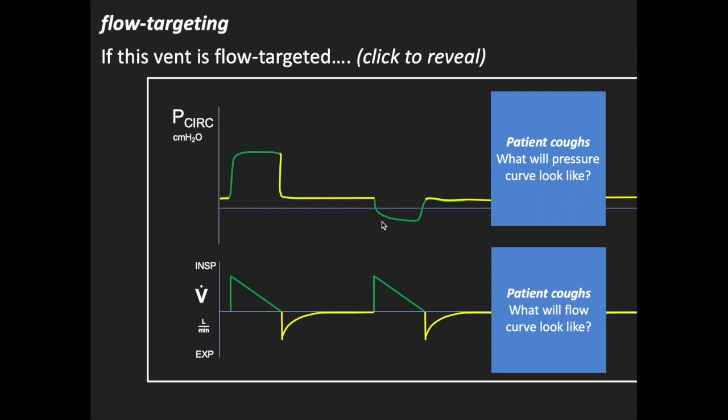If you see this, it's almost like the patient is breathing harder, working harder to breathe than they would be if you just extubated them. Because if they were extubated, they wouldn't generate a big negative pressure as a result of a flow restriction like this. They would be allowed just by breathing in the atmosphere to breathe in faster. But this is a case where the ventilator is preventing the patient from breathing in any faster, and as a result, the pressure in the tube drops low.